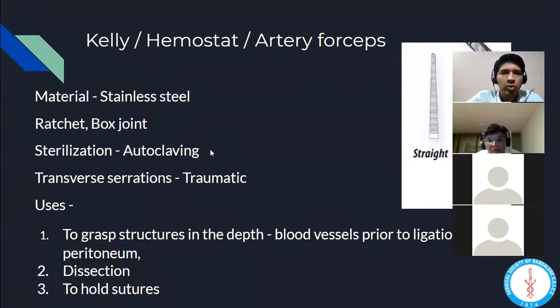All right. So now we have already discussed most of the points. The last two points: this is used to grab tissues in order for you to suture, and obviously to hold suture materials, the tip of the suture materials, and it's also used for dissection.